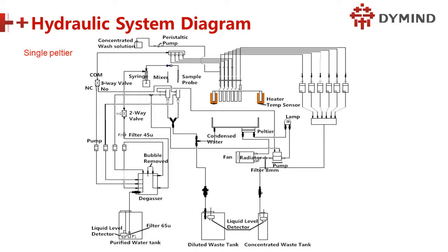Okay, just a moment ago I introduced the feeding and assembling, similar to the hematologist doing the dispensation, right? So next we have to do the cleaning. So we have a cleaning station. This is a cleaning station.